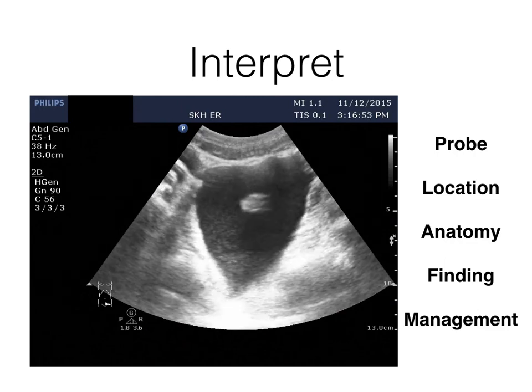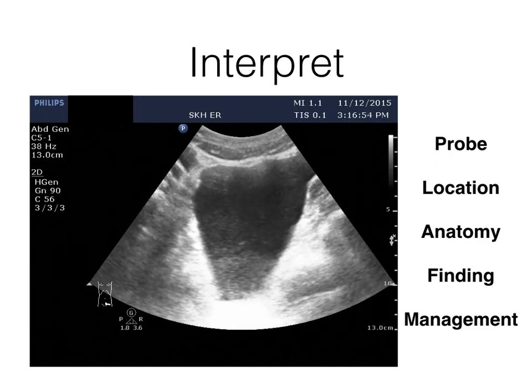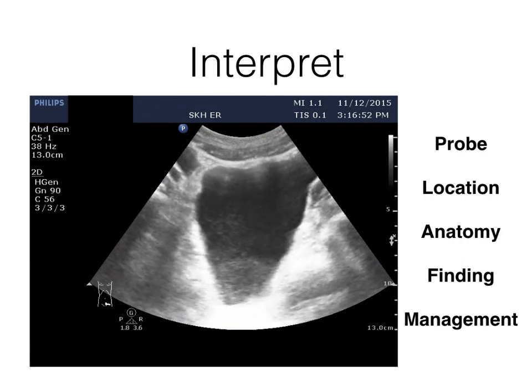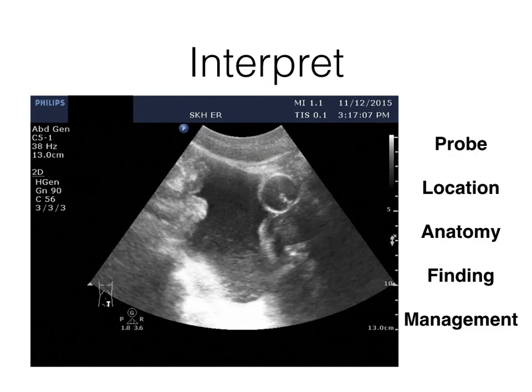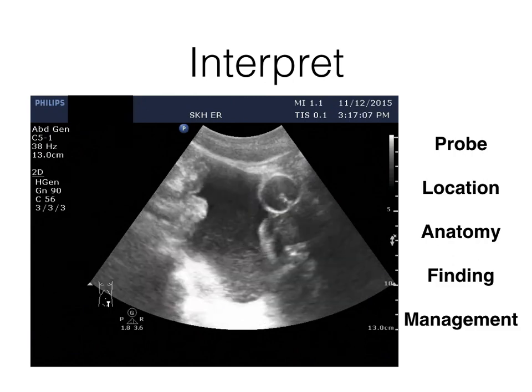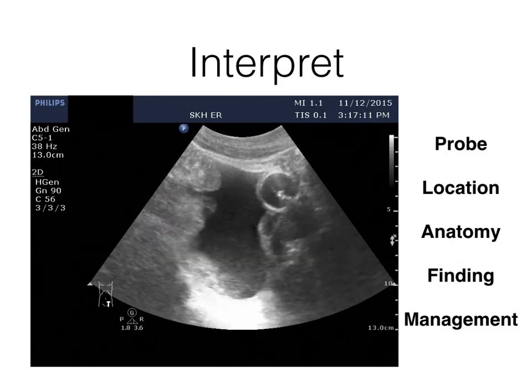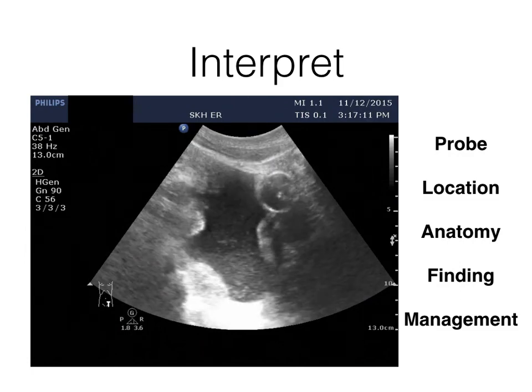So every time we have to scan by swiping, tilting to see the whole organ, the whole interface. Otherwise, you will misinterpret this as bladder, but actually it is ascites with clotted echogenic blood at the dependent part. Then move to sagittal. The patient's got a catheter inside, right? So it's free fluid. Sometimes we will see the patient's bladder is collapsed. So we have to check these regions in different axes, transversely and longitudinally.